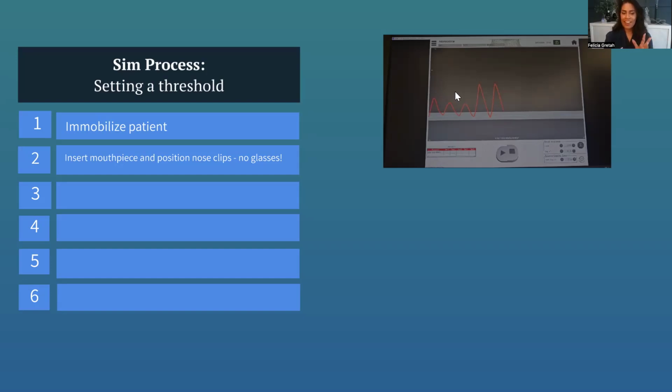The phenomenon of self-conscious breathing is real. People tend to alter their breathing if they know they're being observed. And if you haven't tried SDX yet, I encourage you to do it. It's actually pretty fun.